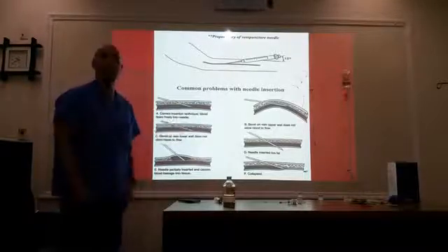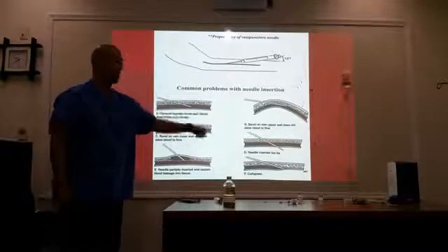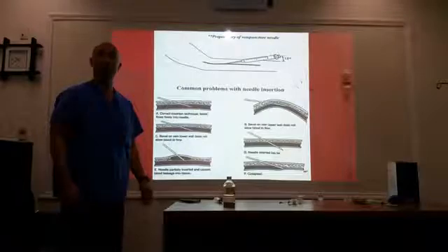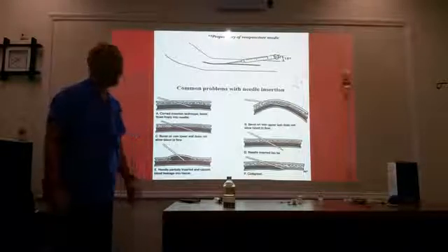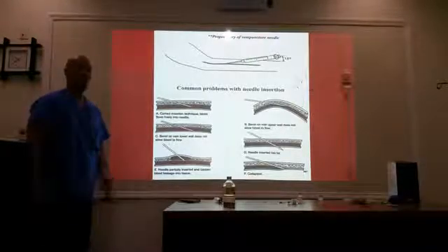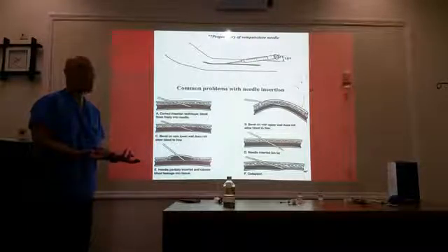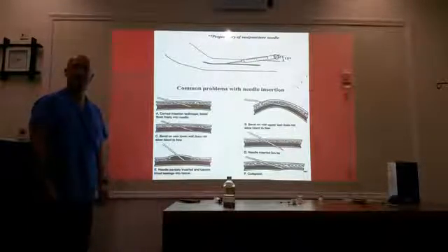It just collapses. All of a sudden, it just goes really frigid and it just collapses. There's nothing you can do about that. Find another vein and stick it. That easy. How would you know if it collapsed? You just get no blood return. You're just like, oh, I know I'm on the right spot, but nothing's happening.